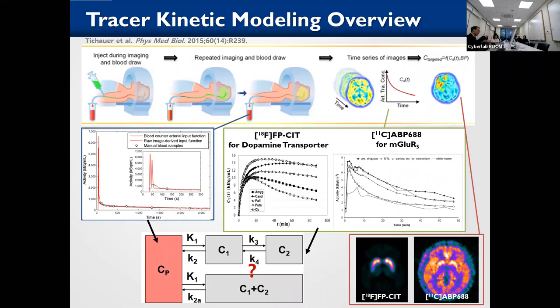That they will be maybe several minutes. All the tracers will be located in the tissue regions. But imagine if we inject the bolus very slowly, then what happens? Can you imagine? If we injected the tracer very slowly.